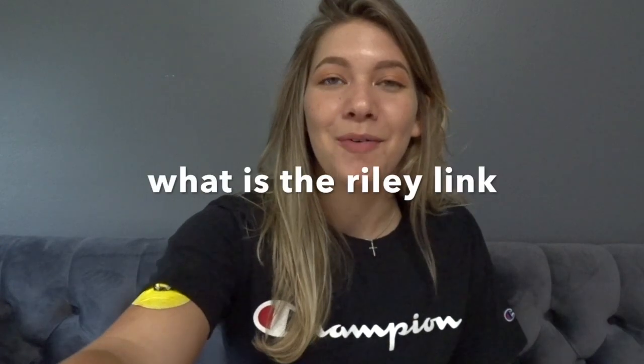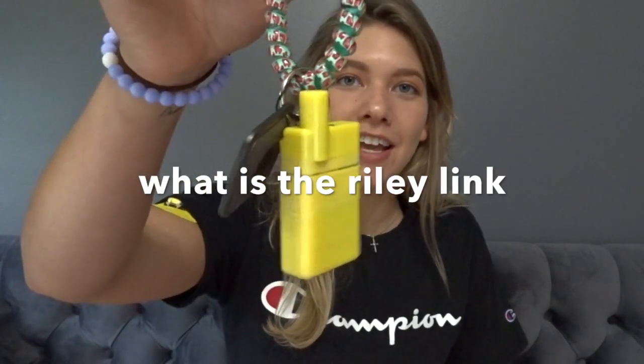So next question is, what is the Riley Link? This is the Riley Link. Like I said, it's $150. It looks like a little computer on the inside. This is where you charge it. This is on and off. Let me compare it to, I have big hands, I'll compare it to an eye. So yeah, it's not big at all.